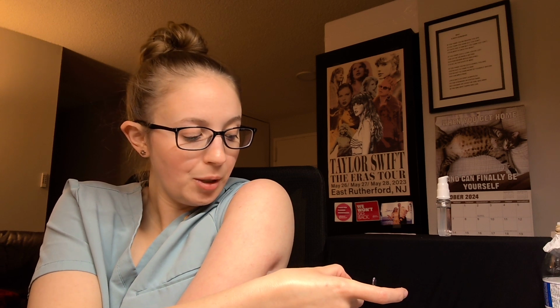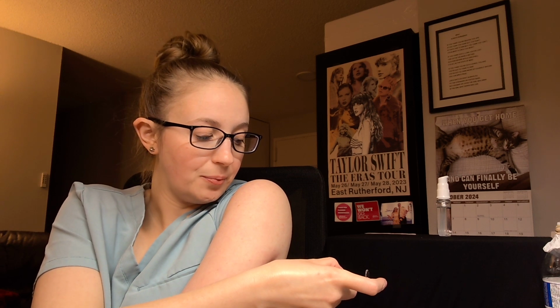If you're feeling any pain when you're injecting, when you're pushing the plunger down, you should stop pushing in the medication, pull out, and get a new needle. What usually happens in those situations is if you're having severe pain, it's because your needle has hit a nerve. So you pull out, you get a fresh new needle. Anytime you inject yourself, you have to do a fresh needle. And you pick a slightly different location to miss that nerve.